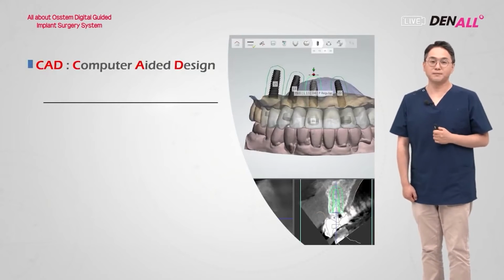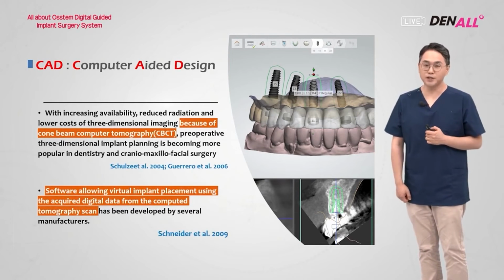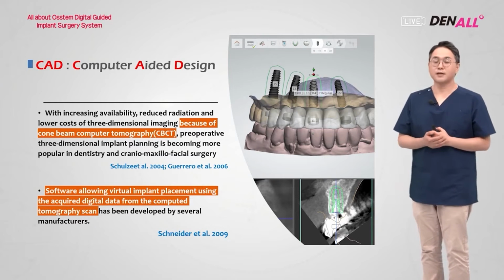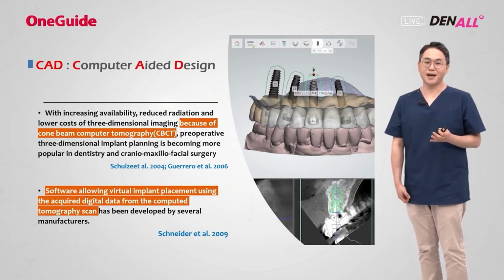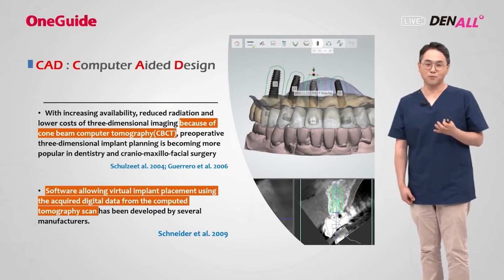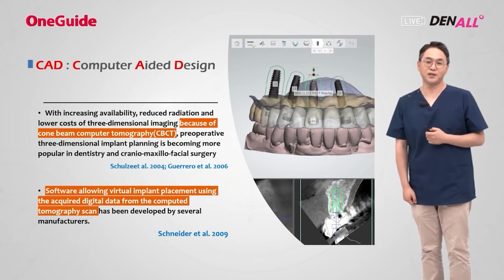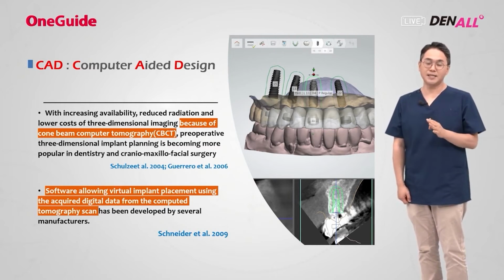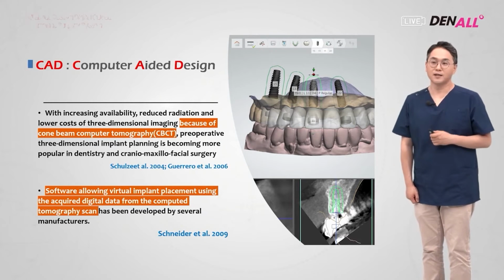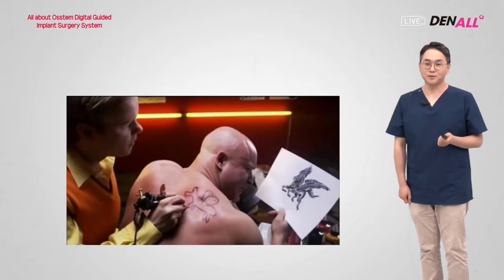Another major contributor is the CAD program. There are a lot of virtual planning software: Blue Sky Plan from Blue Sky Bio, Implant Studio from 3Shape, ExoCAD's ExoPlan. There are multiple software where you can plan implant placement. Based on the CT data gathered, you can plan implant placement. That's called a CAD program.